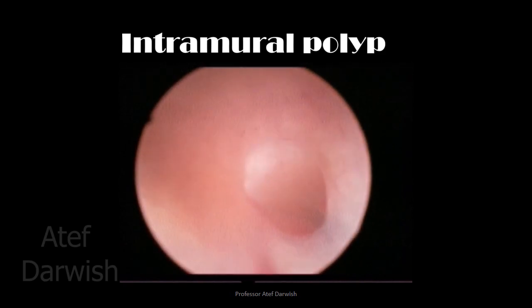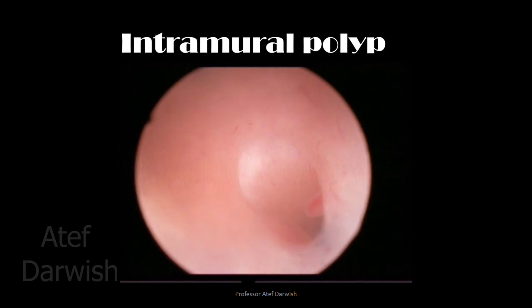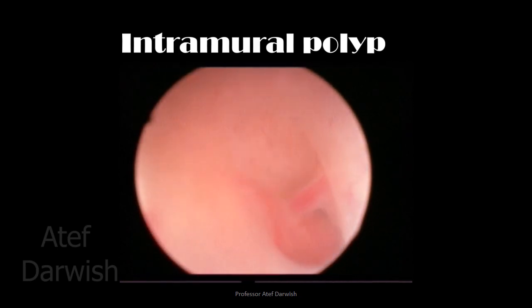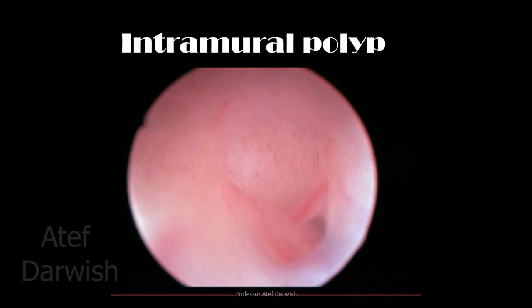Sometimes you can see the triad appearing normal, but if you focus on it and wait some time, you can see polyps coming from the intramural part of the fallopian tube, representing a cause of infertility by making occlusion of the ostium against ascent of the sperms. You have to be more meticulous during hysteroscopic examination — please don't forget to concentrate on the Darwish triad to detect any lesion hidden by routine hysteroscopy.